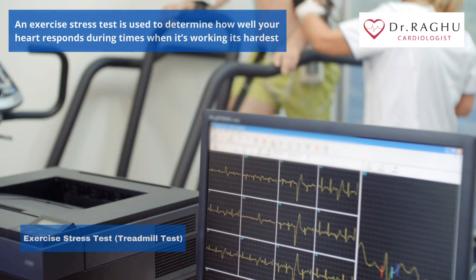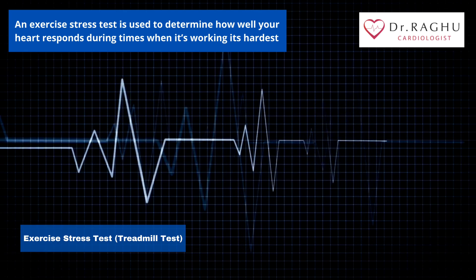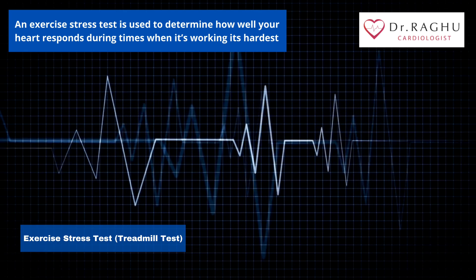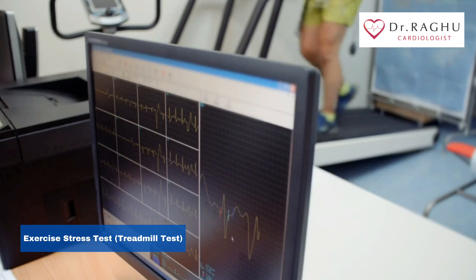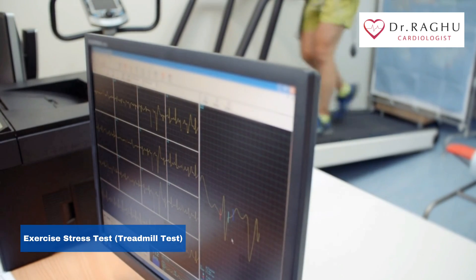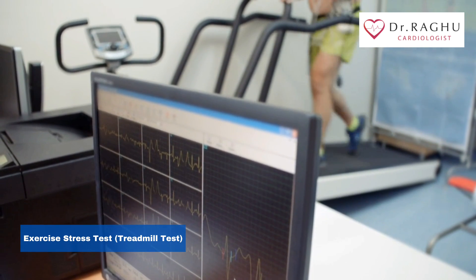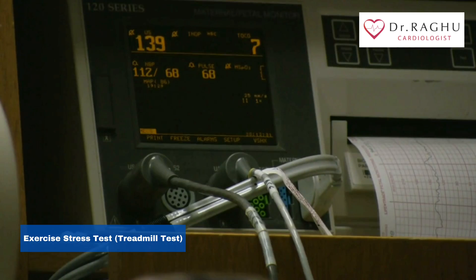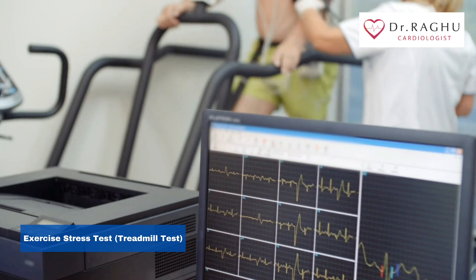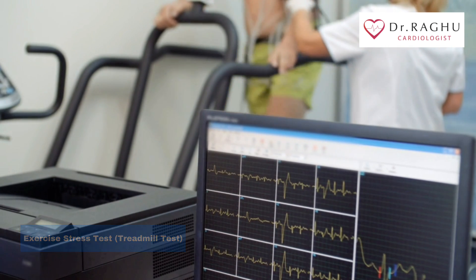An exercise stress test is used to determine how well your heart responds during times when it's working its hardest. During the test, you'll be asked to exercise, typically on a treadmill, while you're hooked up to an electrocardiogram machine. This allows your doctor to monitor your heart rate. The exercise stress test is also referred to as an exercise test or treadmill test.